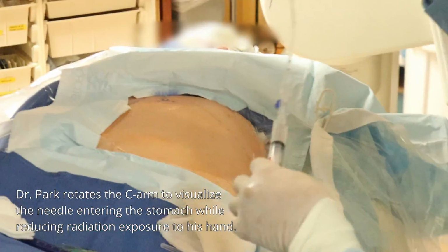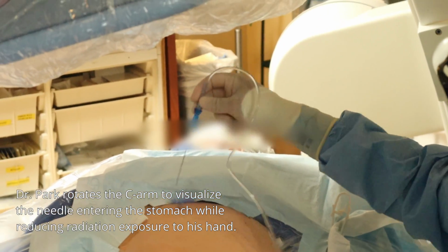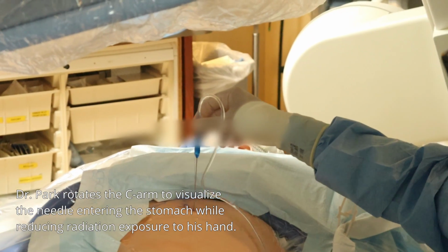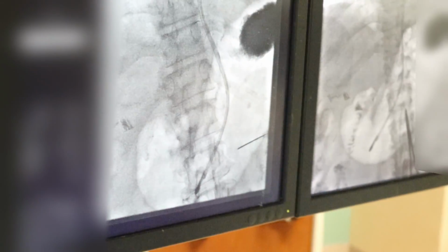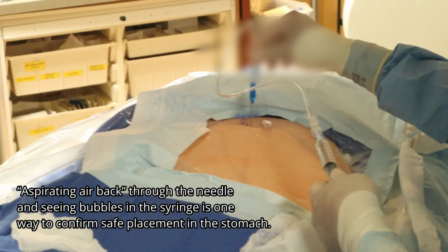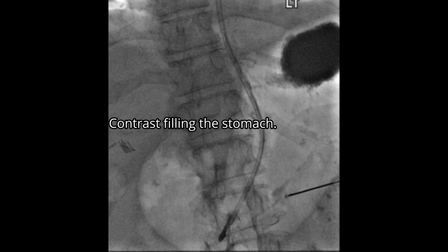You still have to make sure that this T-tack needle goes straight down, perpendicular to the wall, so not at an angle like this. We want this to be a nice and tight anchor. So still 90 degrees straight down, but we are a little bit right oblique, so my hand should be out of the way. I'm going to keep going until you see the needle going into the stomach. I'm going to aspirate. Aspirate the air back. Air is out. So I'm going to inject some contrast. Right, the stomach.